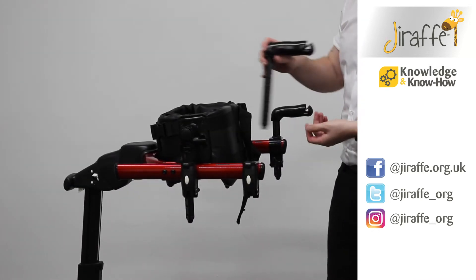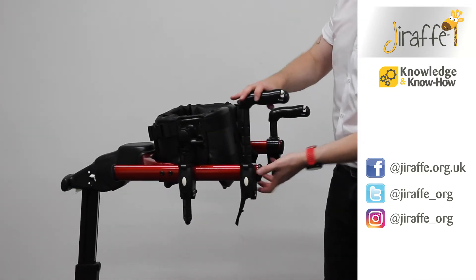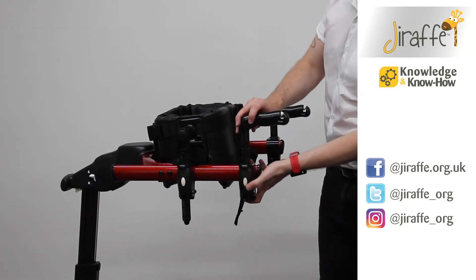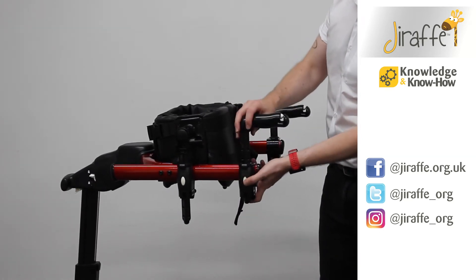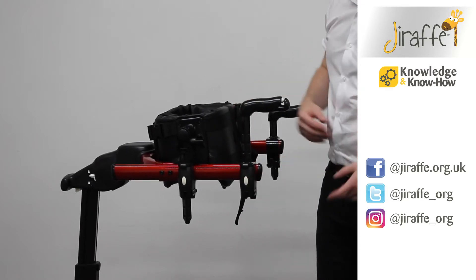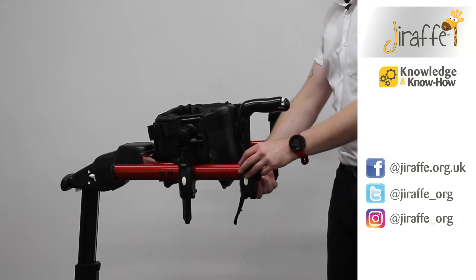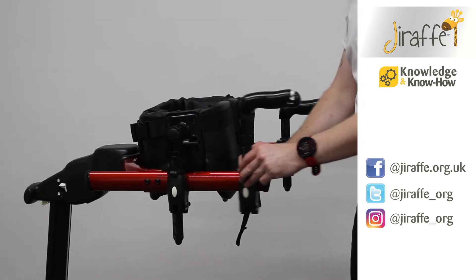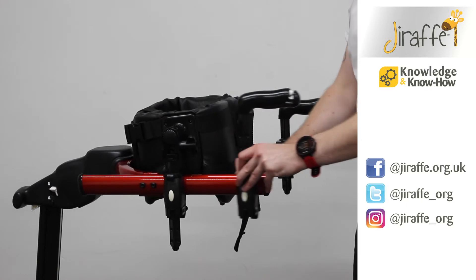We can then take our handhold and place it into the top of the clasp, and then the white button can adjust the height of the handhold. If we need to move it along the frame, we can simply loosen the wing knob and move it anywhere along the frame.